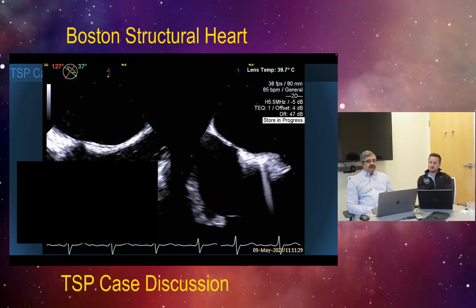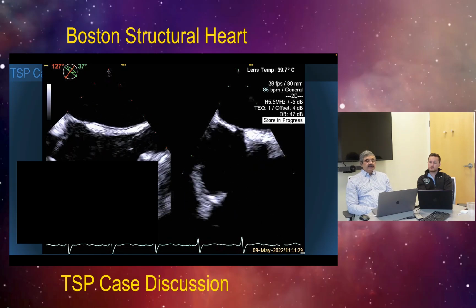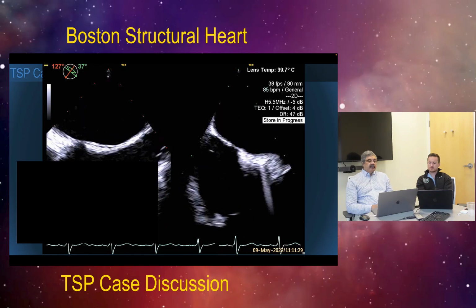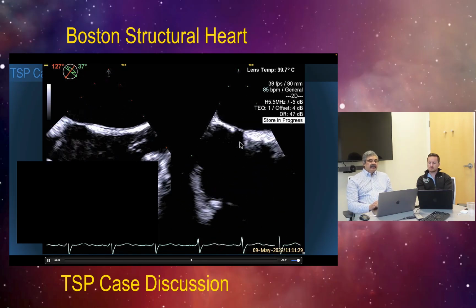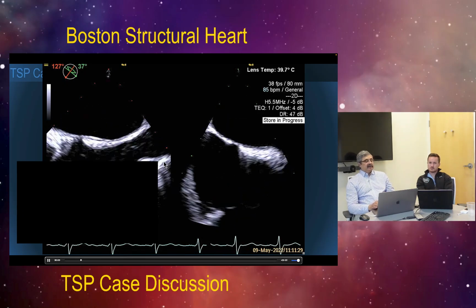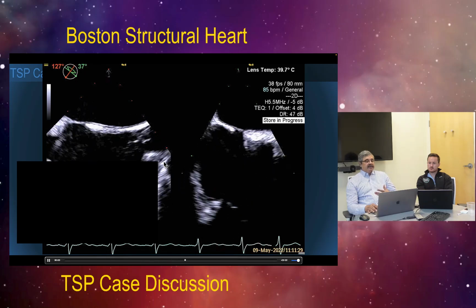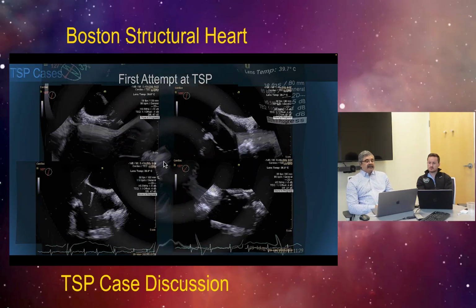We are again tracking this needle, and now this was a rather high stakes case because the patient also had an intra-aortic balloon pump, and we had to deal with this thing very quickly. Based on these two views, you can see that the target area is very small. So this is somewhat easy because there's not much finesse you can do, but also difficult because you have to time it right so that you go across the right place.